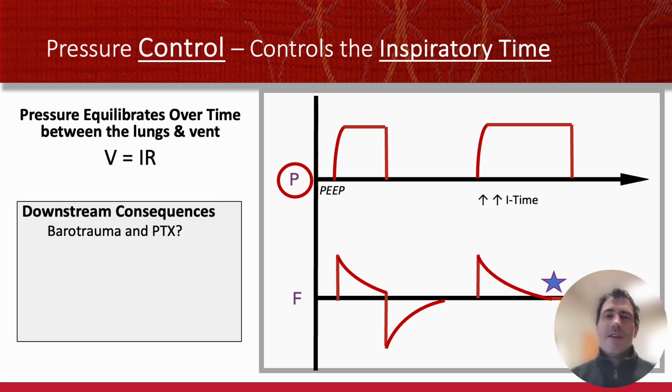Inspiratory pauses, when I ask about them in lectures, I always hear that these could be dangerous. But they're not maybe too dangerous in the way you think about it. They don't add pressure, so barotrauma is less likely, and similarly, they're not going to add pressure in air where pneumothorax becomes a problem because you've set the pressure. And really, the amount of air going in by that extra little bit of time is not much.